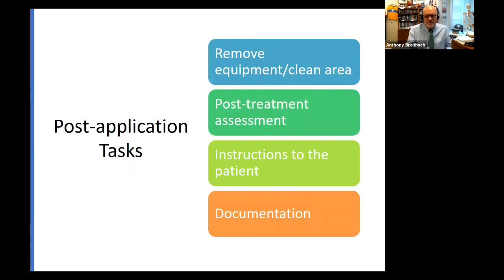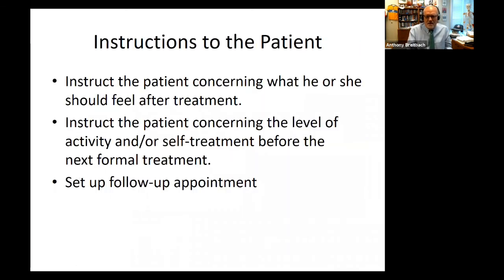Post-application tasks, you want to remove the equipment, clean the area. Post-treatment assessment, give some instructions to the patient and document. Instructions to the patient, you want to tell them what they'll feel after treatment. Many times after a treatment, they'll be more sore later, okay, because we're doing something with this area. So you want to tell them that. You want to tell them what they can do for self-treatment. Maybe you can take some over-the-counter medicine. Maybe you can apply another ice treatment later, those types of things, and set up follow-up appointments.